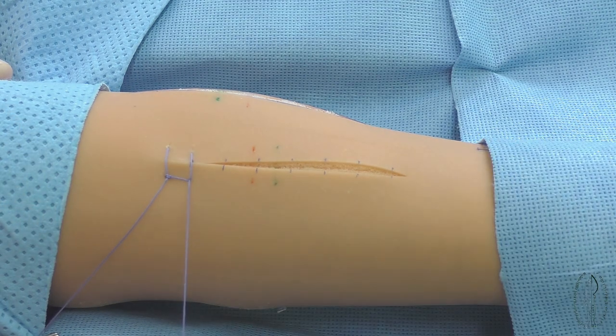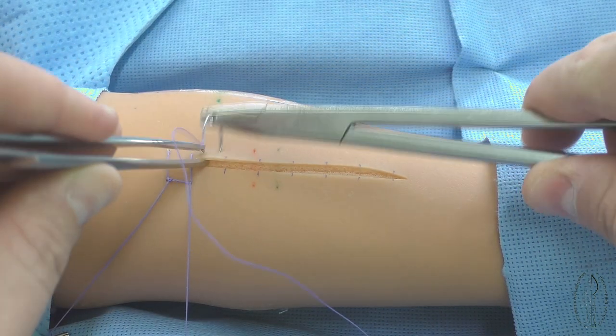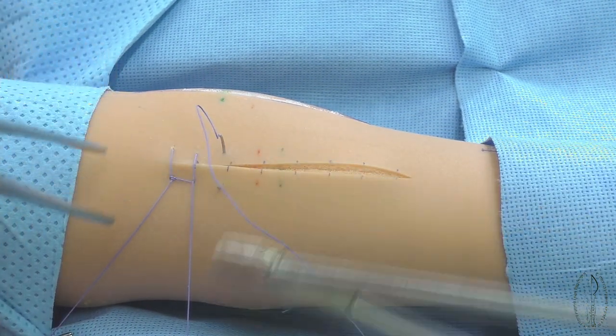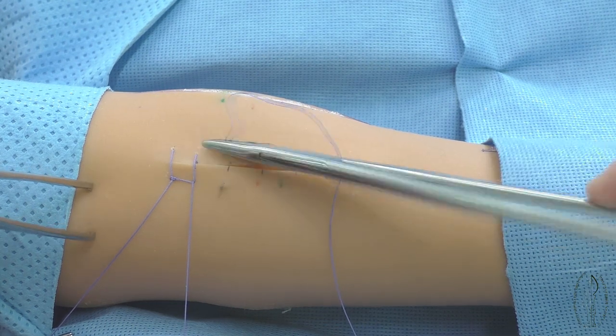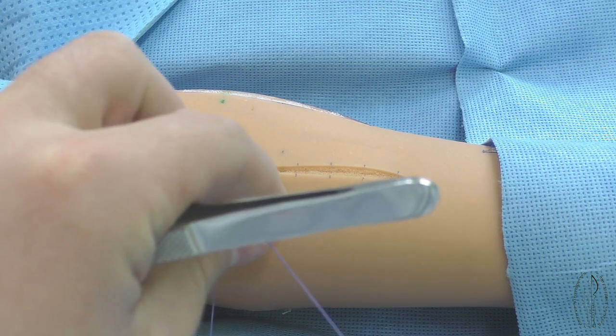The loop can be thrown on the needle by an assistant or a surgeon. This manipulation gives a specific feature to the suture: the filament is consistently located across and along the edges of the incision.